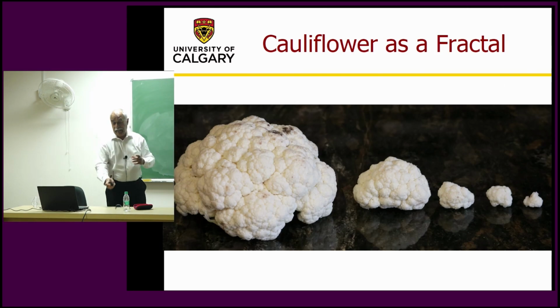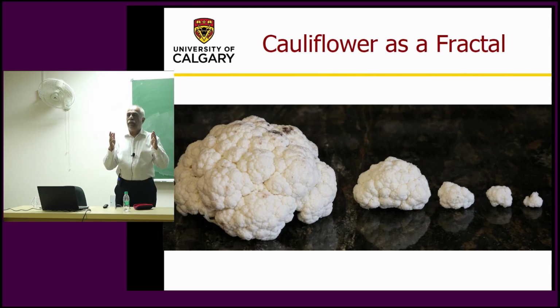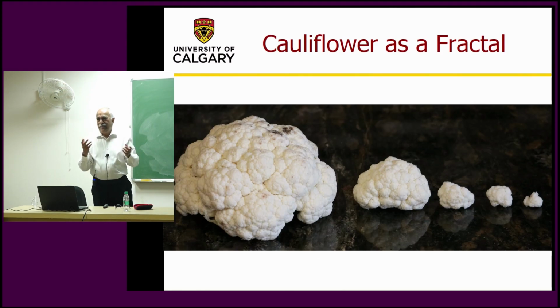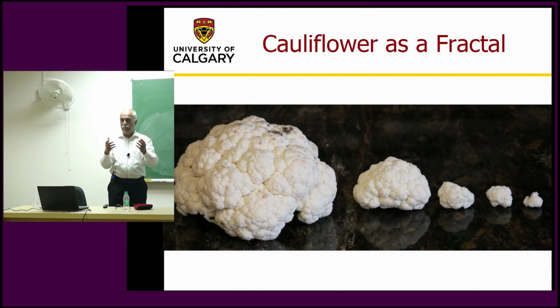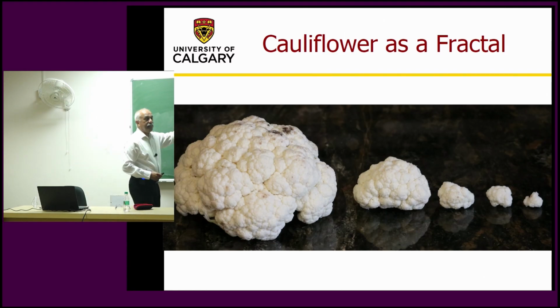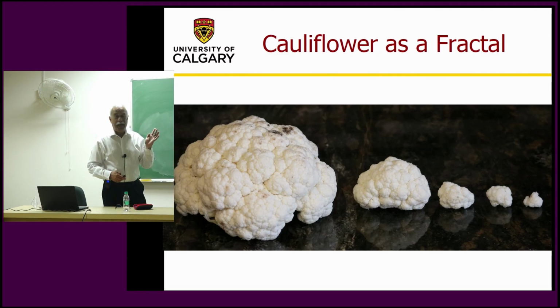A physical object rather. Now, given a fixed image of 1,000 by 1,000 pixels, let's say, you want to downsample it to see what happens at some other scale. If you zoom in, then cut it to 512 by 512 and so on. Go to smaller and smaller scale. But after maybe 100 by 100, anything smaller, there is not enough number of pixels there to form the pattern that you want to see. So there is a limit in a given discretized image or in a given physical object. There are limits to how many scales of this repetition of pattern can exist.